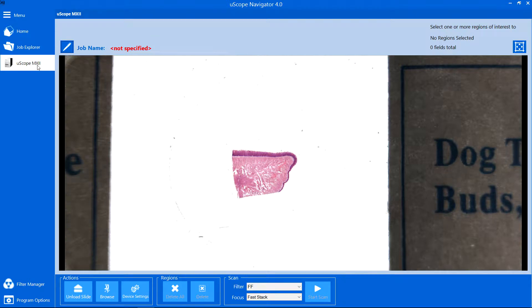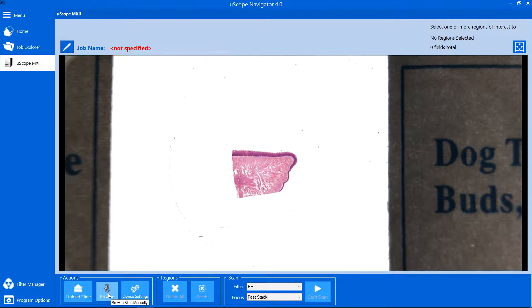The Uscope tab opens the control panel, which allows you to load and unload slides, browse, and scan a region of interest. In addition, device-specific settings are accessed from the Uscope control panel.